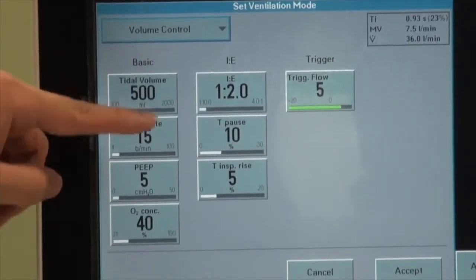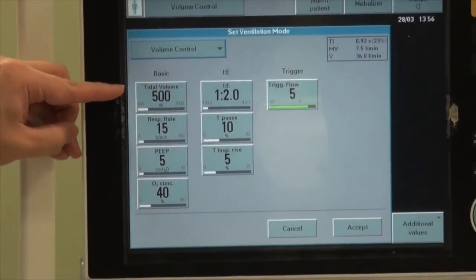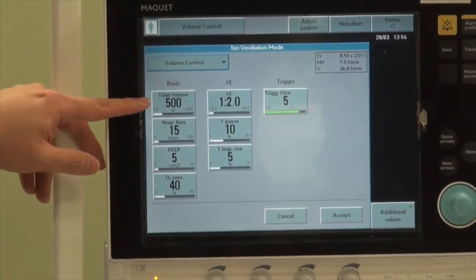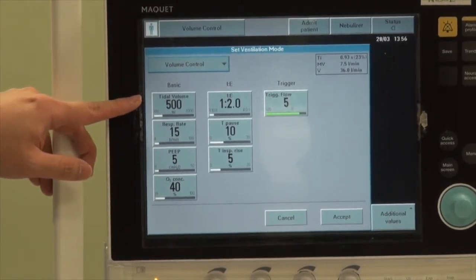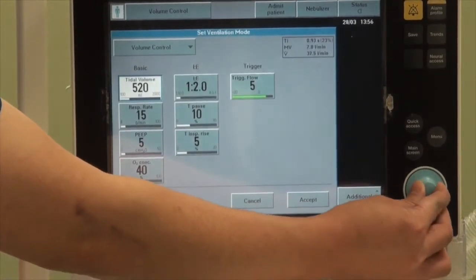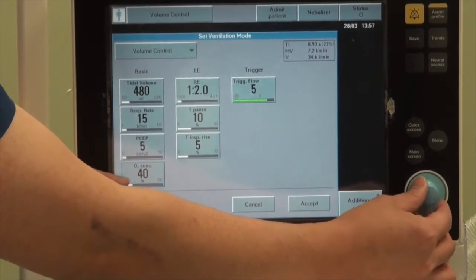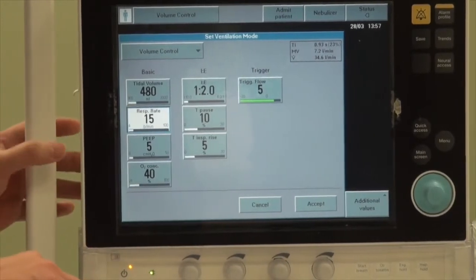When volume control is selected, you will be able to set the various variables. Because this is volume control, we set the target volume for the ventilator. The appropriate initial tidal volume is about 6 to 8 mL per kg of ideal body weight. You can adjust it by pressing down on the button and turning the blue dial at the side, then press down on the dial to lock it in. You can also use the dial to navigate different variables or touch the screen to select specific settings.